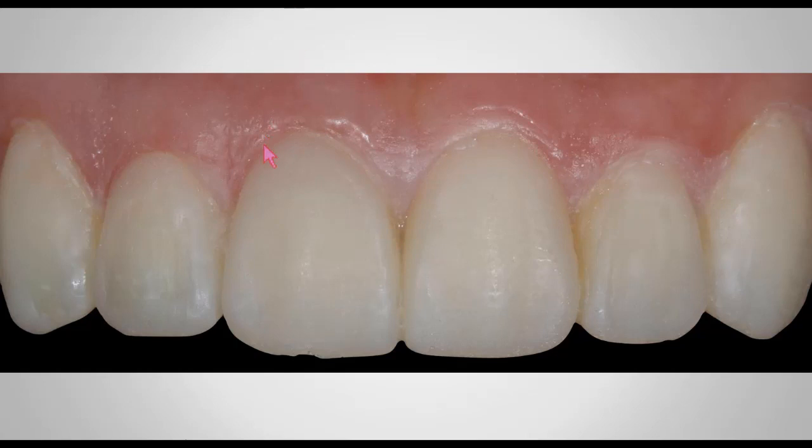You can see that I have some flash in between each prototype, but you can see as well how thin it is. It is so thin that you can see the redness or the pink of the tissue underneath this flowable composite that has been polymerized beyond the gingival margin of each tooth. And yeah, you may get a little bubble here and there. They're very easy to repair. You can see how small they are, so they're very, very easy to repair.